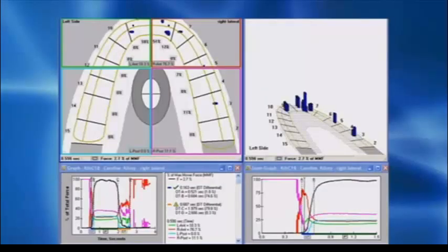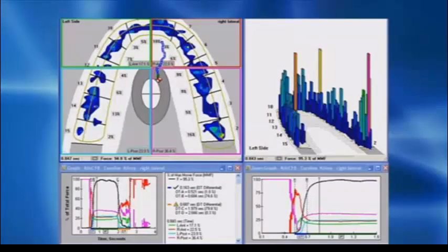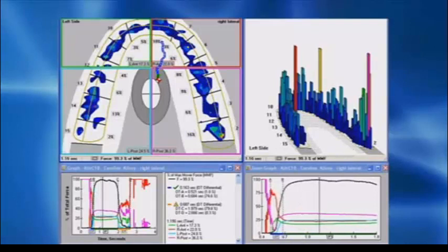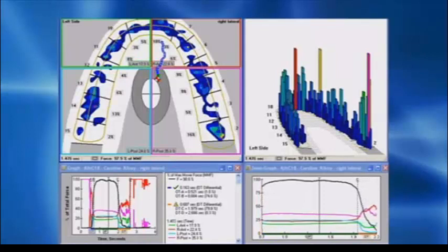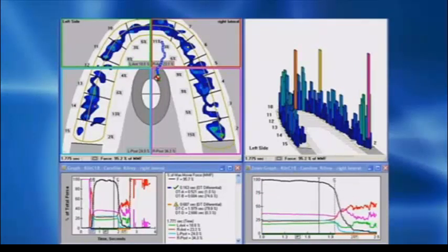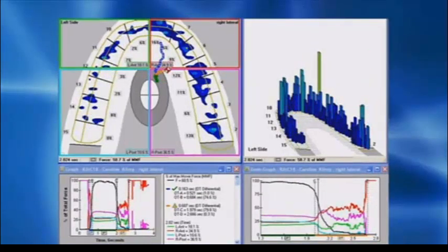So now, Caroline, when you close, you're much more balanced. You're a little more right-sided than absolutely perfectly balanced, but you're much more centered with your center of force. It doesn't travel way off to one side, which is a significant improvement, and the total center of force is more forward and within the middle of occlusion. When you slide to the right, your right side stays in play a little bit longer than I would like.